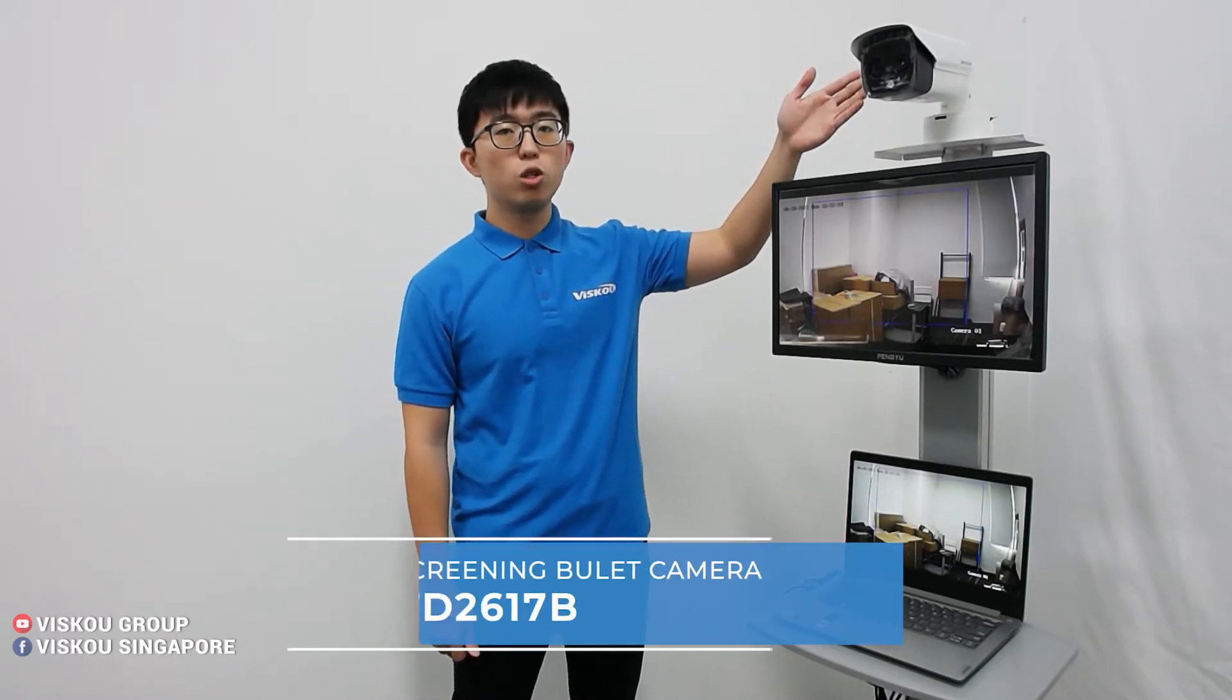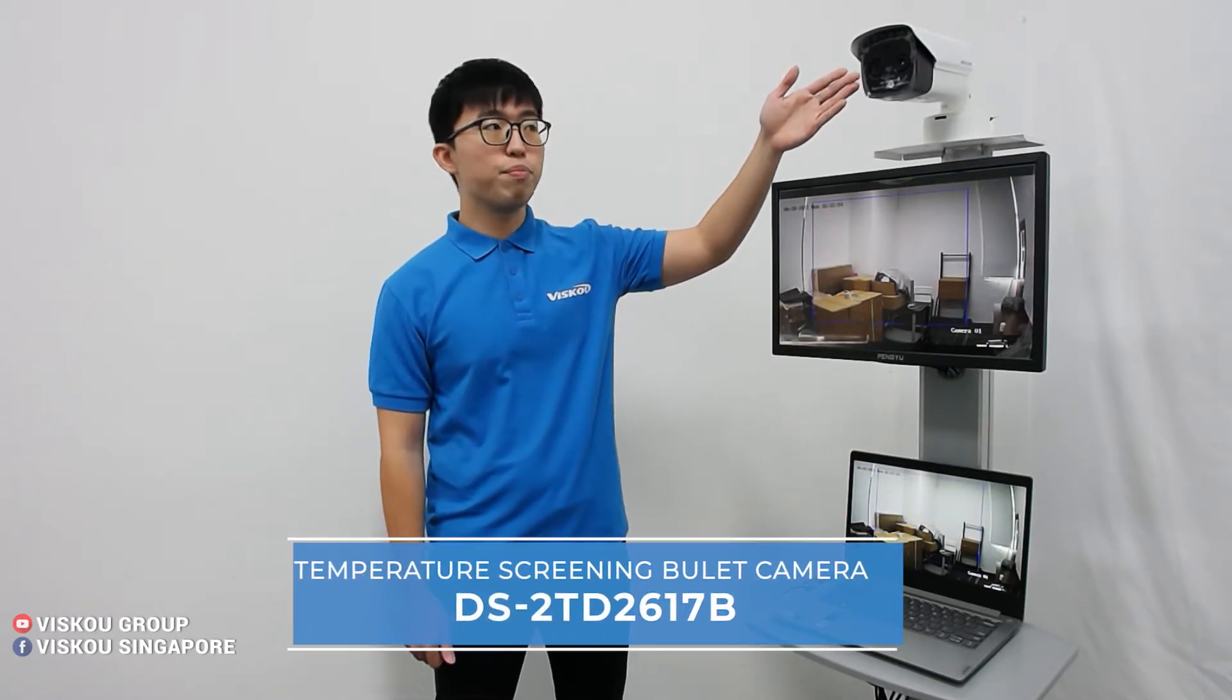Hi everyone, welcome to Viskou. Today I am here to introduce you to our Hikvision temperature screening bullet camera, model DS-2TD2617B.